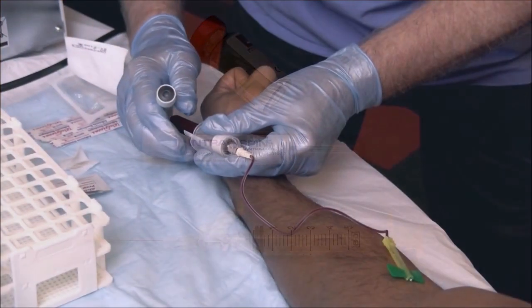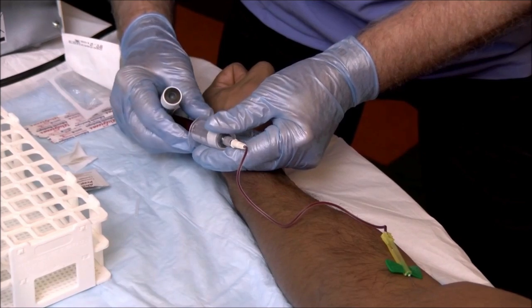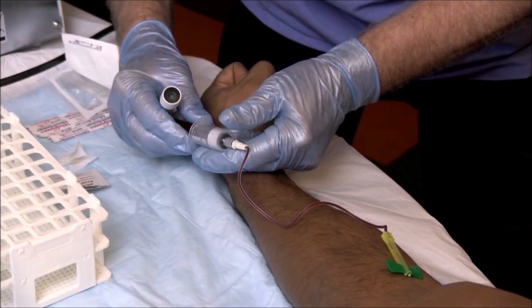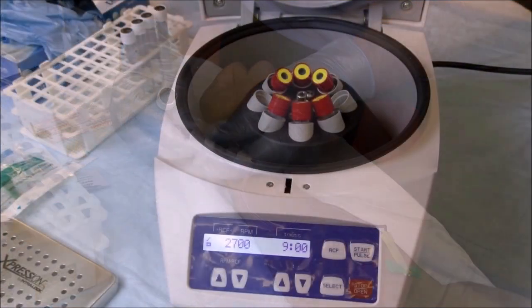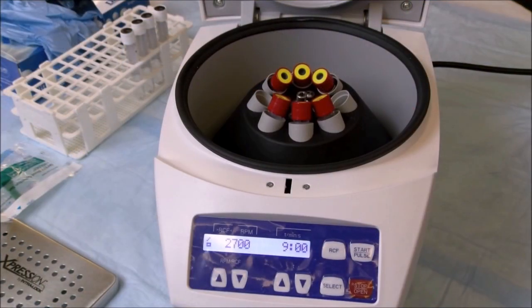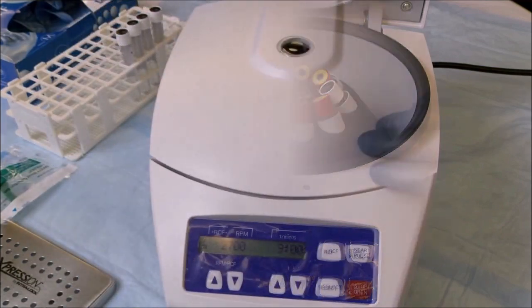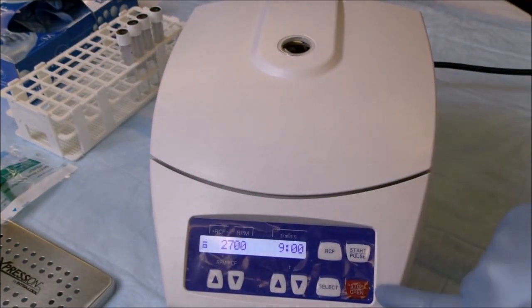Blood is drawn in a normal phlebotomy procedure, with the white top tubes always being drawn last. The vacuotainer tubes are placed into the centrifuge in a balanced fashion. The lid is then closed, and the spin cycle is initiated.